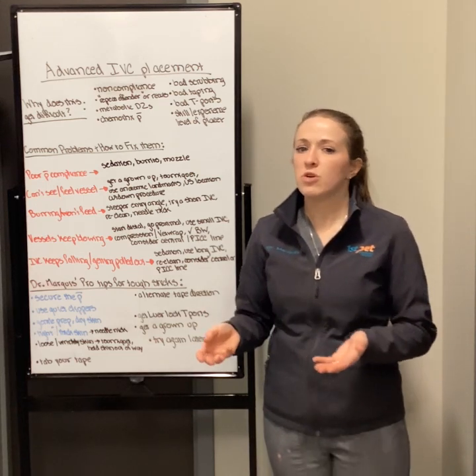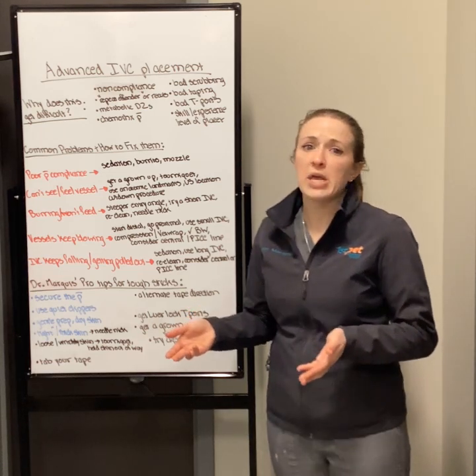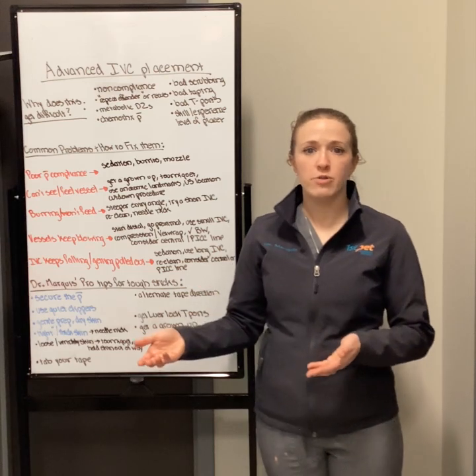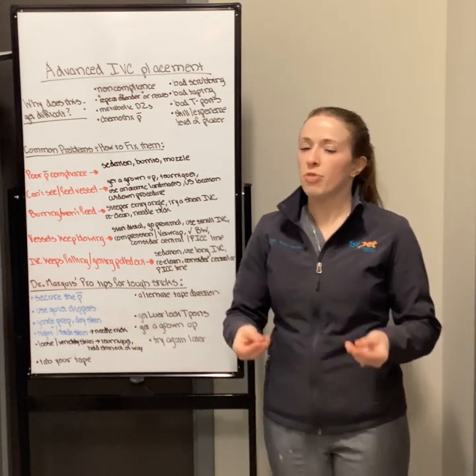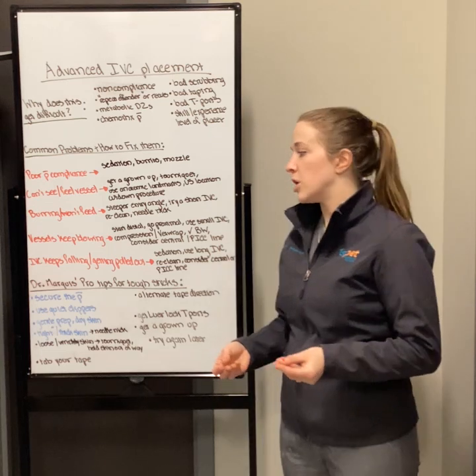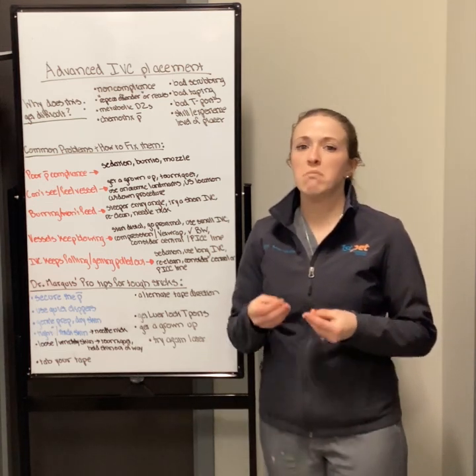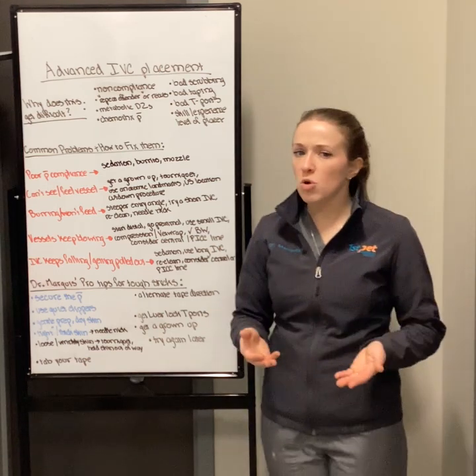Don't get someone who just got hired yesterday and doesn't know how to safely handle the aggressive dog. It's not that we don't want to teach everyone how to do that. We absolutely can, but we have to be safe for both the patient, the person, and the doctor. So whether that means physical restraint or using sedation, make sure that you have that and you are comfortable. Use quiet clippers.